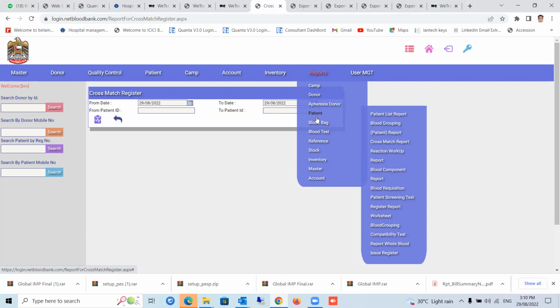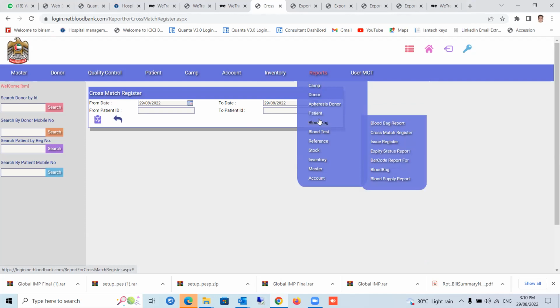The same software can also be ported directly to the cloud, so you can access it via a dedicated internet connection. So both things are possible, offline and online software.